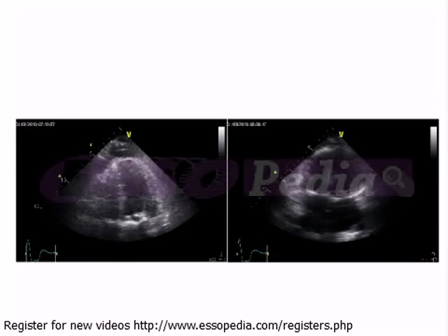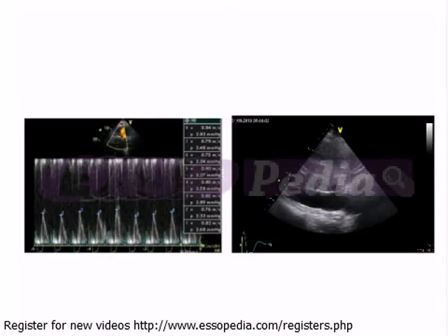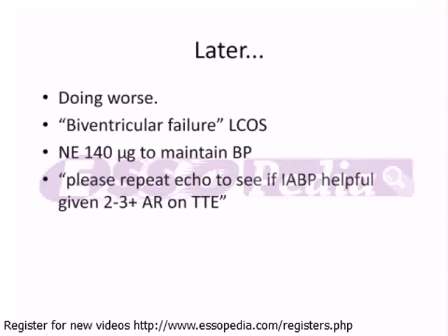From the panel on the left, we're looking at transtricuspid inflow. You can see there's very little variation in the velocity across the tricuspid valve, and when looking at the inferior vena cava, on the right, the inferior vena cava appears dilated, and when scanned in real time, there was no collapse. This patient, of course, as most sick patients early in their postoperative course, is being ventilated by positive pressure ventilation. So the diagnosis was right ventricular dysfunction and was treated in the usual manner.